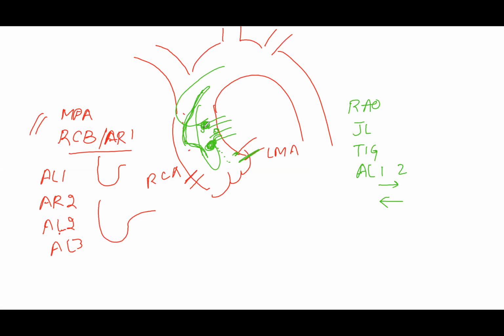And then if they don't work, then I start getting hockey stick, something with a long curve, or EBU: hockey stick 2, hockey stick 1, EBU, JCL. JCL works. And in this direction, I keep on moving to get that side. But RAO is what I prefer.